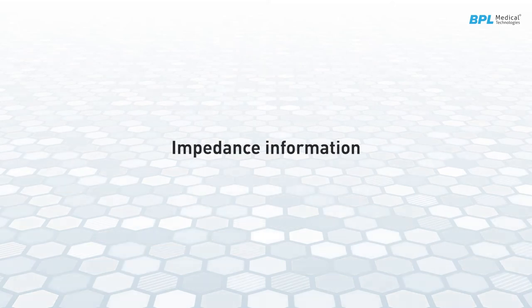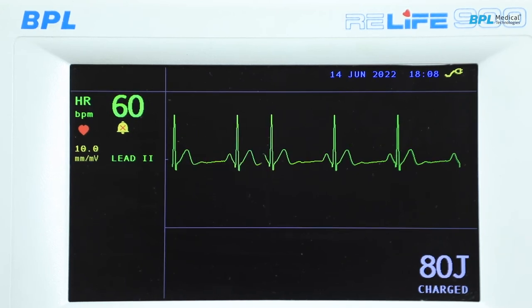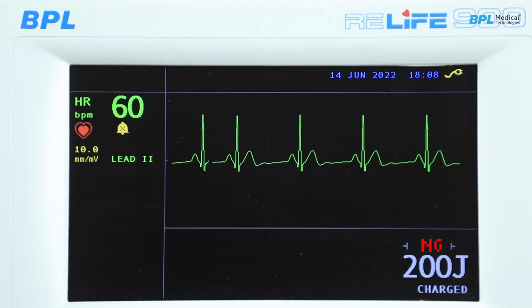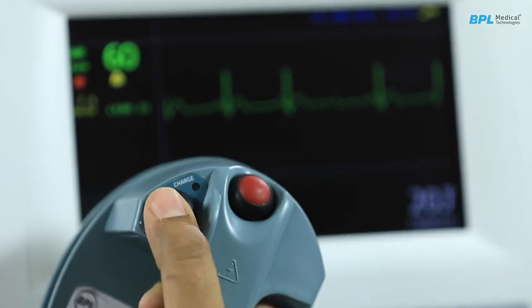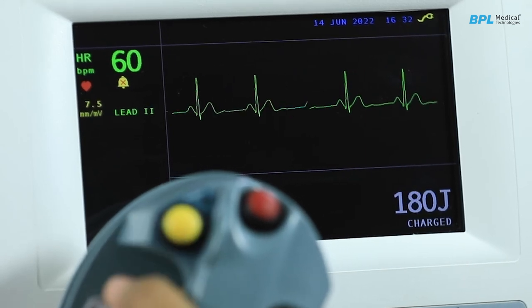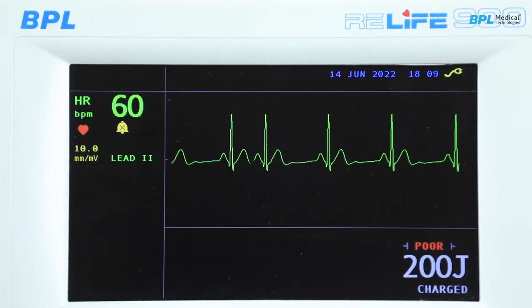Impedance information. This area displays the message related to paddle contact impedance. For example, NG. This message is displayed if the paddle contact impedance is not good. It is advisable not to deliver shock when the message is displayed. Similarly, poor. This message is displayed if the paddle contact impedance is beyond allowable limits. At this impedance level, the energy is discharged internally.